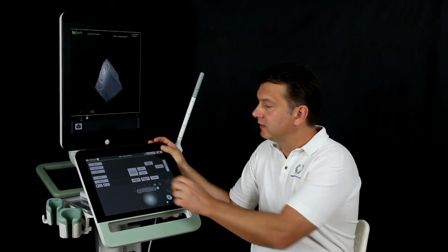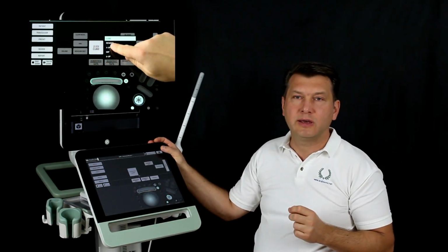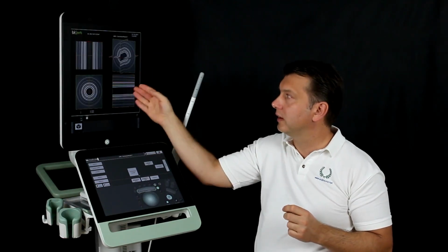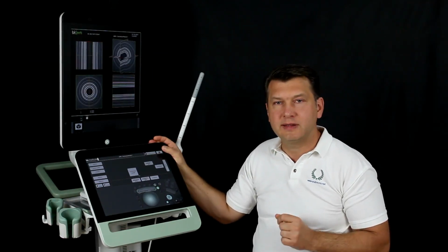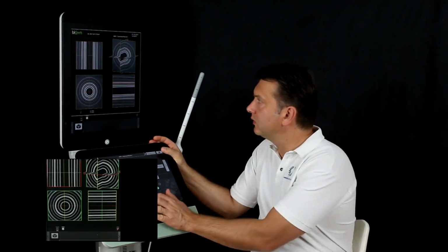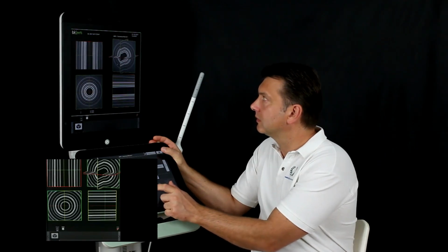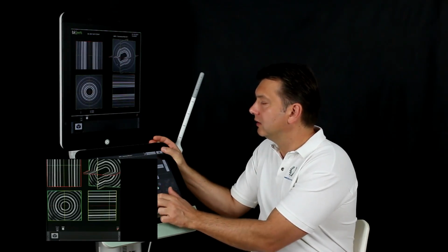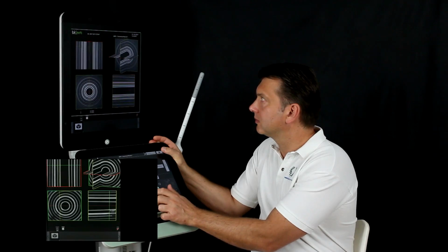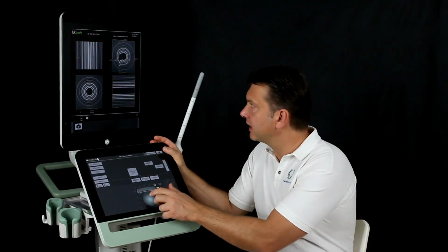Next mode is 4 up mode. It shows the cube in 3 levels, from above, from the front and from the side. All these levels can be moved freely and independently of each other. For this purpose we go to the level, click on it and push. After that we release by clicking again.